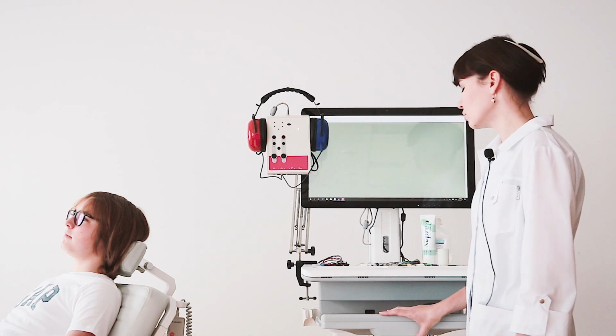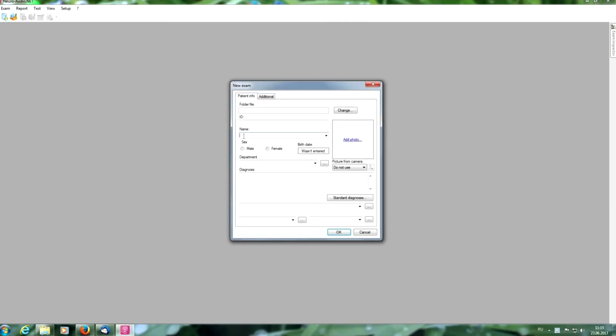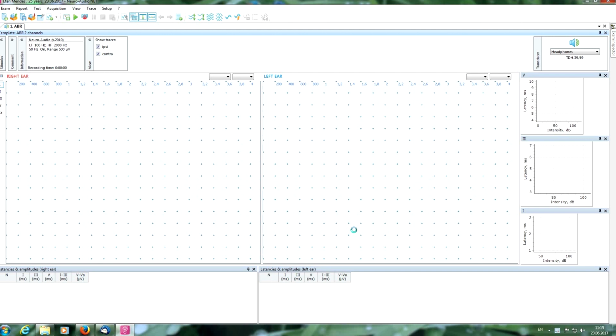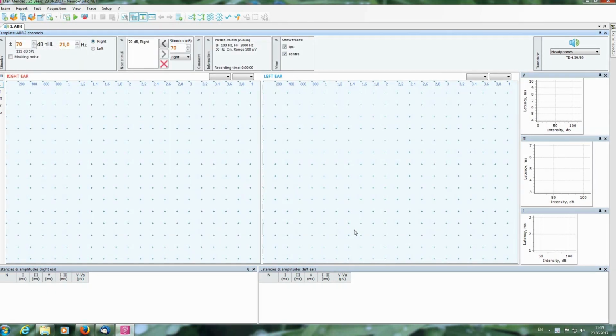Now we can run the neuroaudio.net program, press the New Exam button and insert the patient's data: name, sex and birth date, and press the OK button. Now we can see a lot of prepared templates for performing different types of tests. We need to choose the necessary one, for example the ABR for 2 channels template, and press OK. Now we are in the main program window for this test.